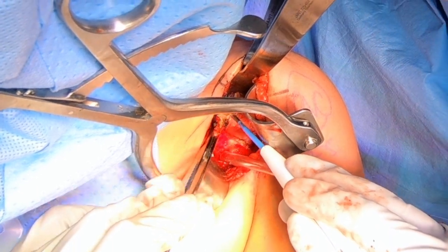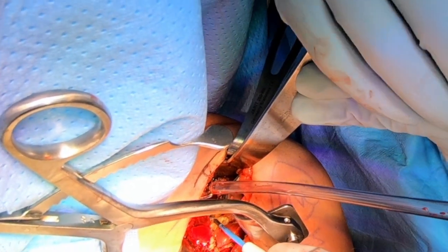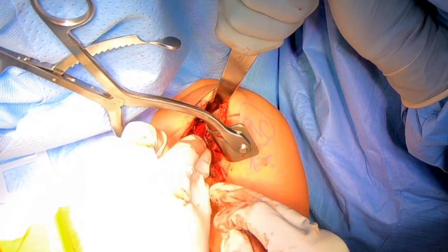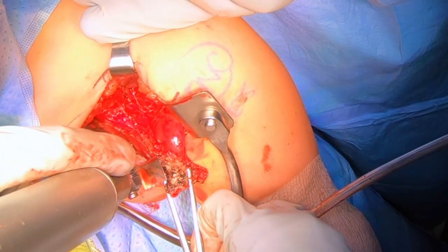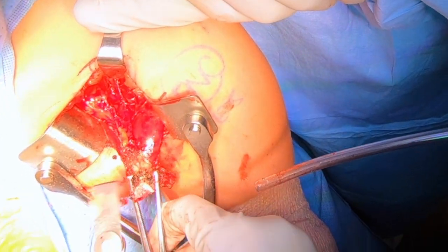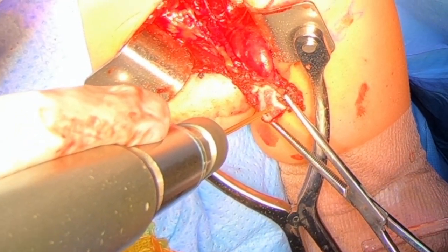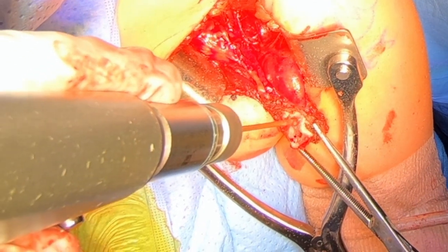The next thing we have to do is carefully prepare the coracoid. A lot of care is taken here to make sure we get a good preparation so that it will heal to the front of the socket. We're careful as there are nerves underneath. We have to have bone-to-bone healing for this procedure, so you'll see me carefully using the saw to create a fresh healing surface on the backside of the coracoid, as that's going to match with the front side of the socket. That edge has to be relatively straight. Here you'll see that we're drilling two holes — later on we'll put two screws through those holes. We'll drill those now so that everything is prepared for our later transfer.